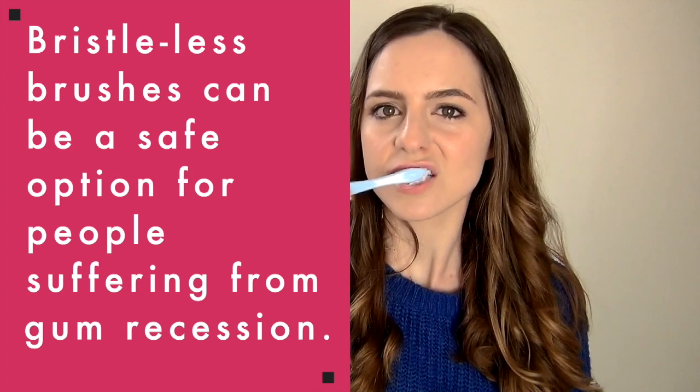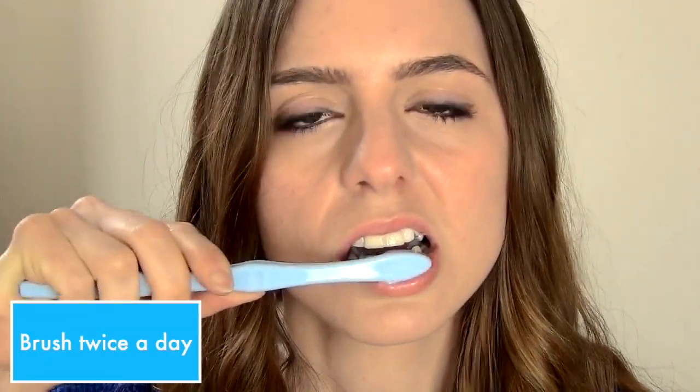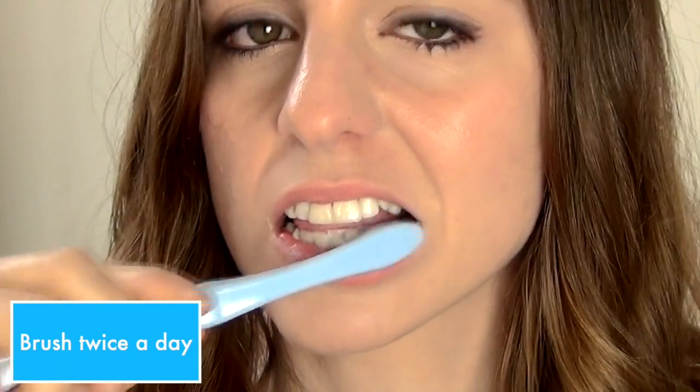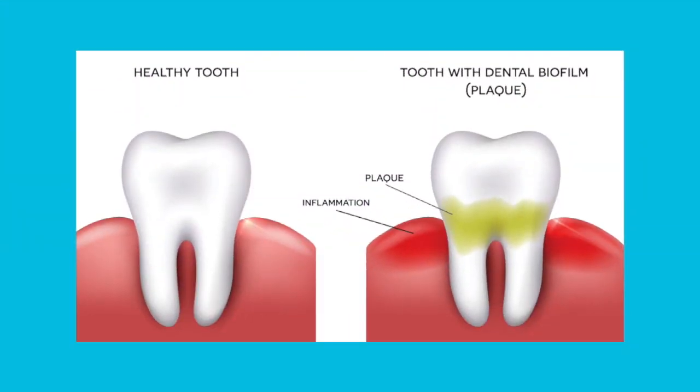If you're used to cleaning your teeth with a hard bristle toothbrush, the Periclean can feel weak by comparison. However, the truth is that plaque doesn't require much force to remove it, provided you brush twice a day. Tests have proven that a soft bristle-less toothbrush like the Periclean is just as effective at removing plaque as a normal toothbrush.